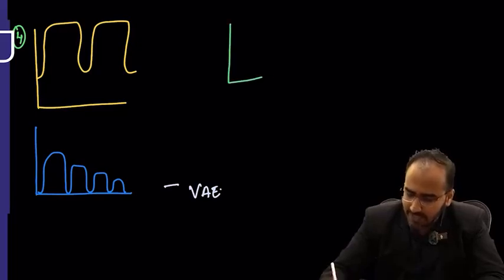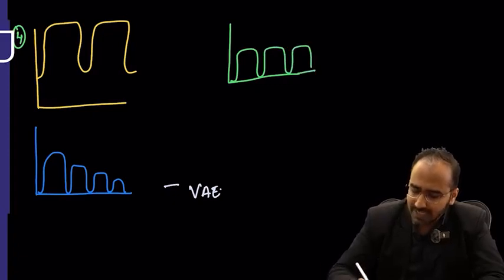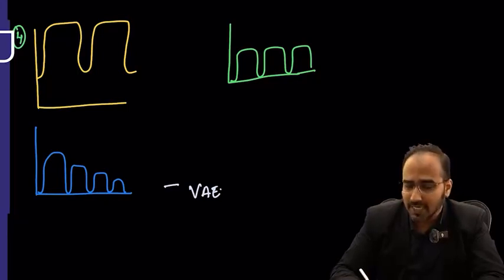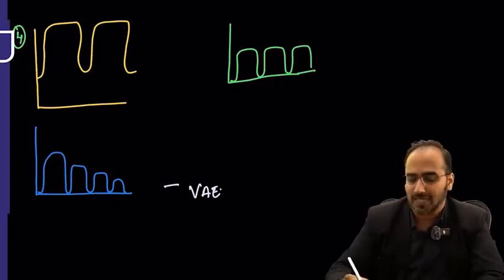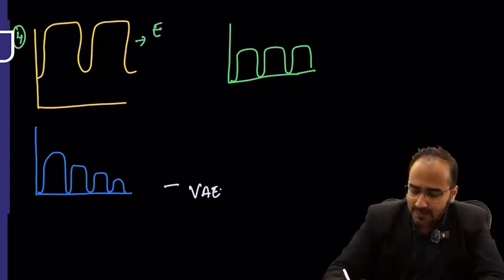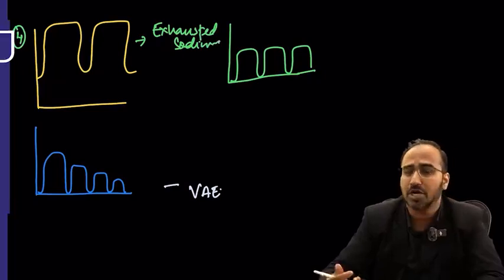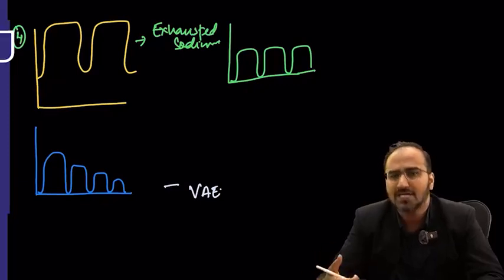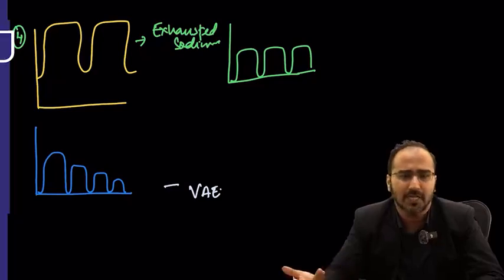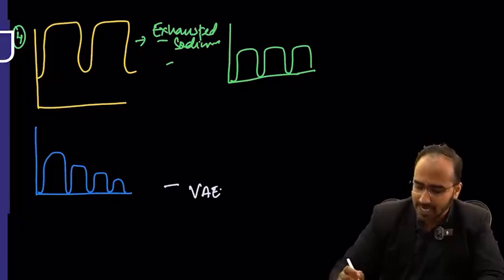Next, first you have to remember the normal capnograph, guys. Normal capnograph is like this. But in this capnograph, from the starting itself, it is rising from above the baseline. When capnograph readings start from above the baseline, that indicates we are using exhausted soda lime. Soda lime's function is to absorb carbon dioxide, but if it is exhausted, you will see a high capnograph, because carbon dioxide is retained and comes into the endotracheal tube.